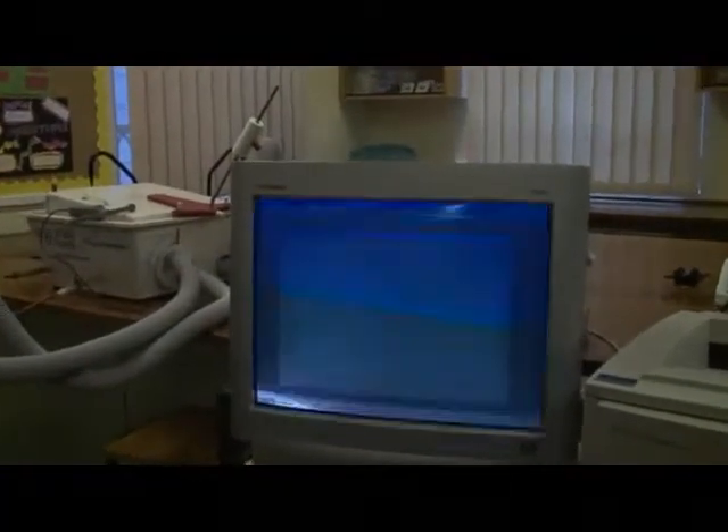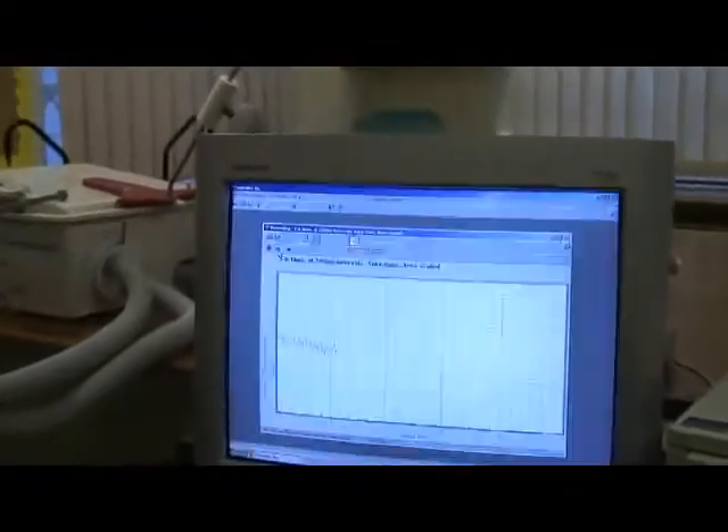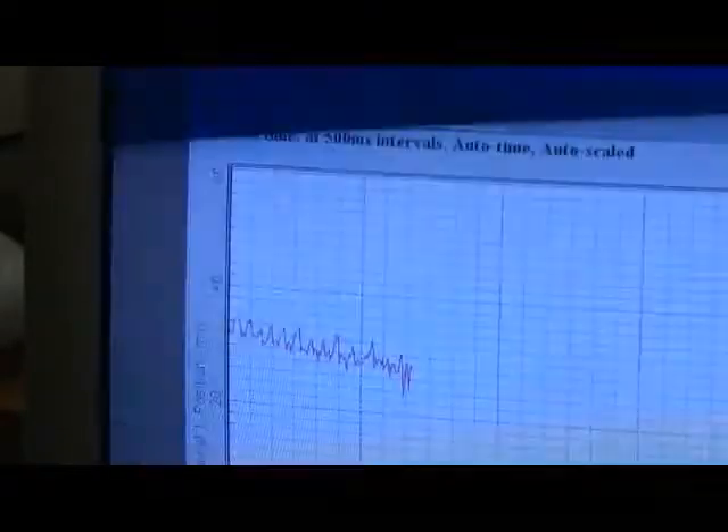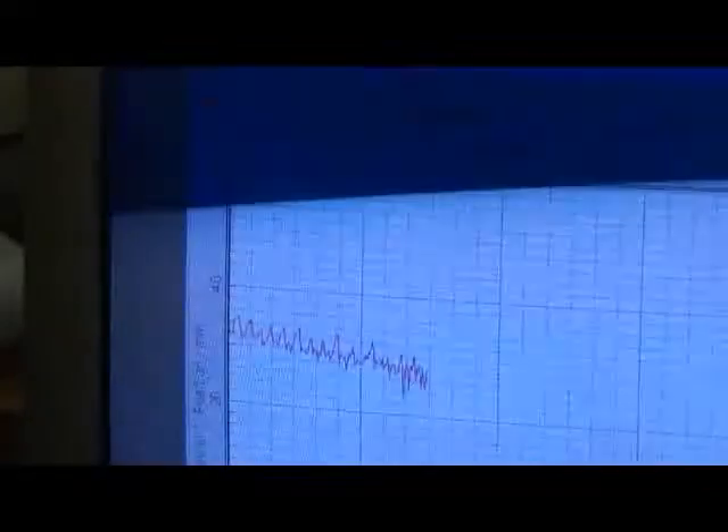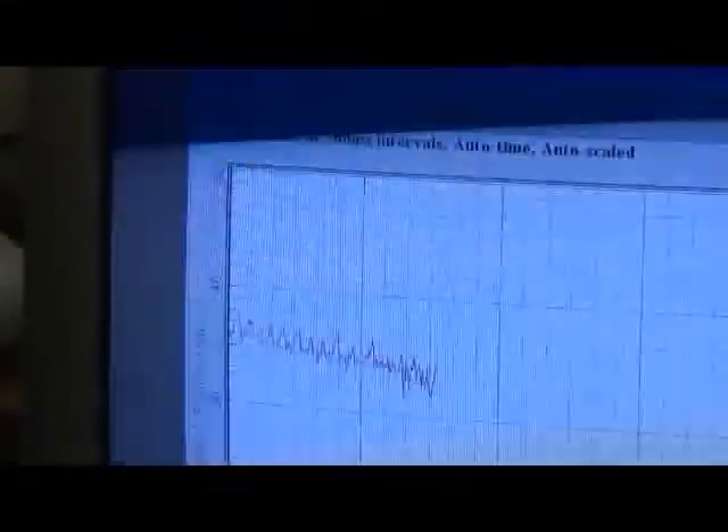You can see a trace on the screen which is going up and down and falling to the right. There's more explanation about that later and on the worksheets, because there is a canister of soda lime between the subject and the spirometer — any carbon dioxide she breathes out will be absorbed, so the total volume inside the apparatus will fall due to the oxygen that she uses. This is why the trace falls to the right.